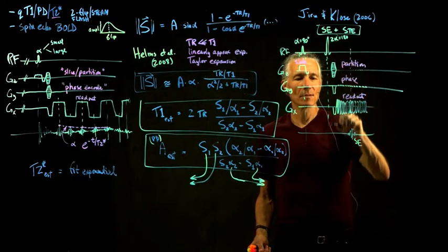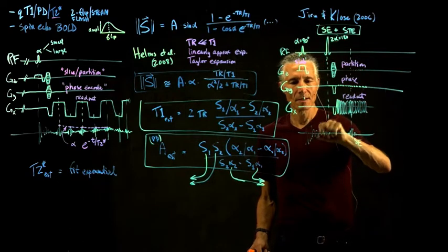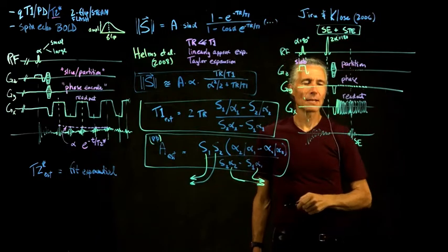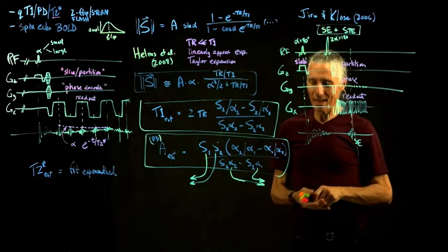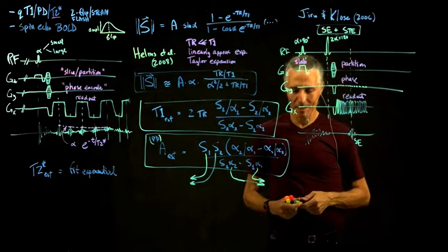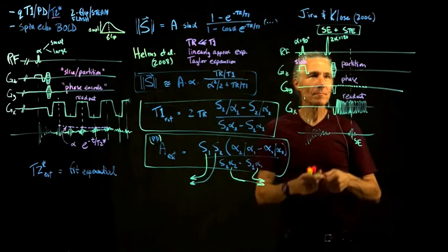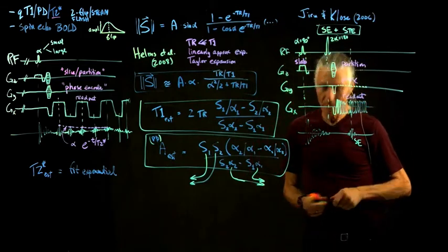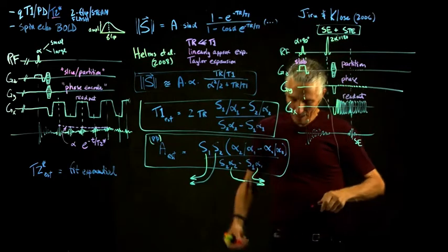There'll be not much there, and there'll be sort of a FID here. So that guy's a spin echo. But we want a spin echo and a stimulated echo, so what we can do now is do another pulse. And so this other pulse is done, so let's draw those times in again.